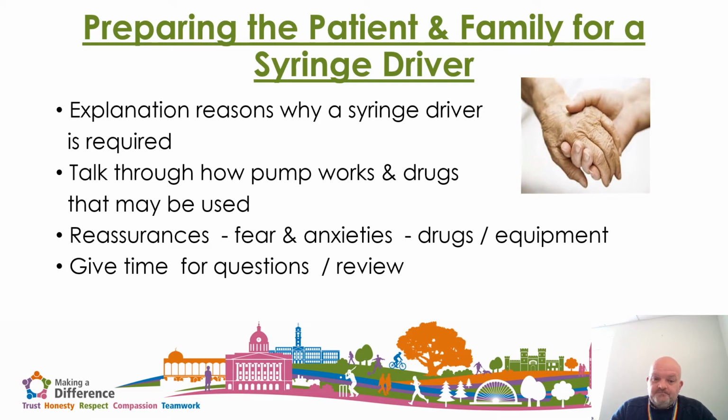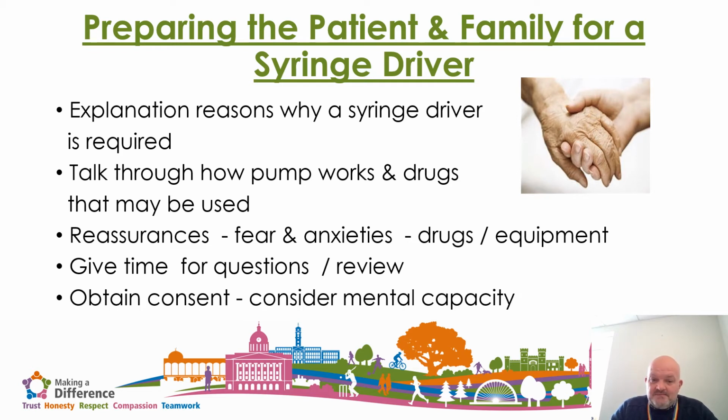We're always going to give time for questions, because that patient needs to be able to ask any questions that they want to, so that they feel comfortable with their decision. And also it's important for them to know that we're not just going to put the syringe driver up and then not come back. When I was working clinically, if a syringe driver was commenced, I would always go back every day for the first few days to make sure the dosages we were using were working for that particular patient.